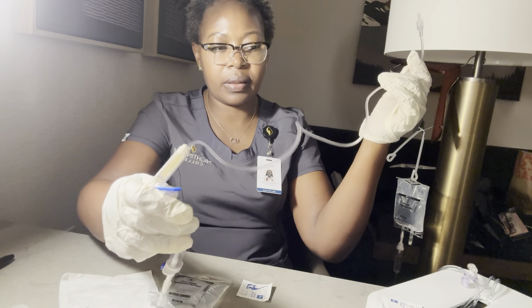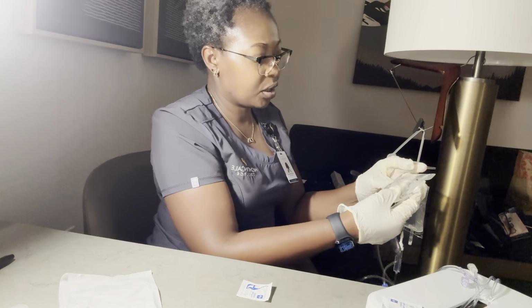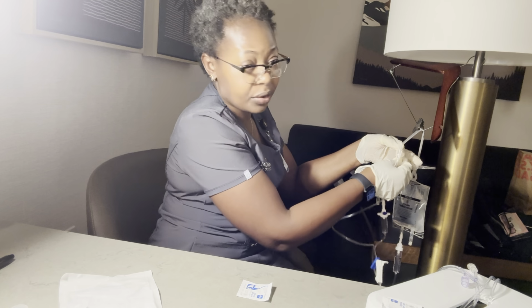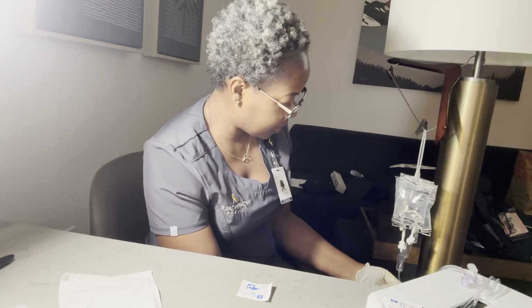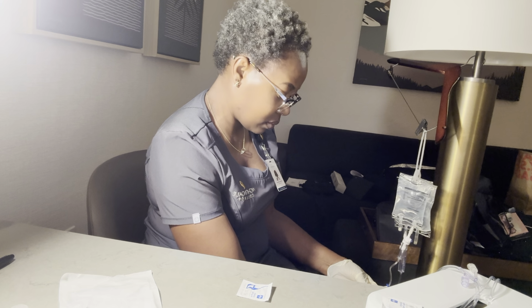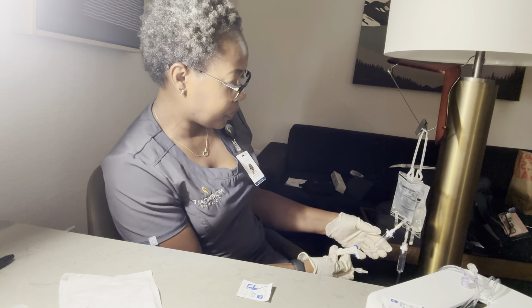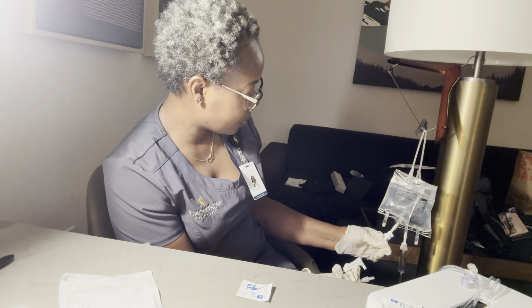Connect to my Y site, but before then I need to prime to make sure there is no air trapped in here. Hang it on the upper side of the hanger. Prime it. Oh, before priming, I will fill the chamber halfway.